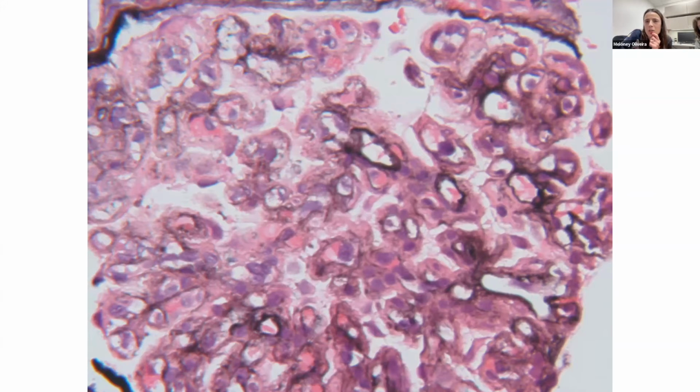What does that tell you? That this has been going on for a long time? Yeah, I mean, we have a membranoproliferative pattern of injury, right? Lobular appearance. And then we have double contouring and remodeling on the silver stain. So it supports MPGN. Well, keep in mind, this guy's had a history of proteinuria for over 10 years. So who knows how long it's been going on. Yeah, very true.